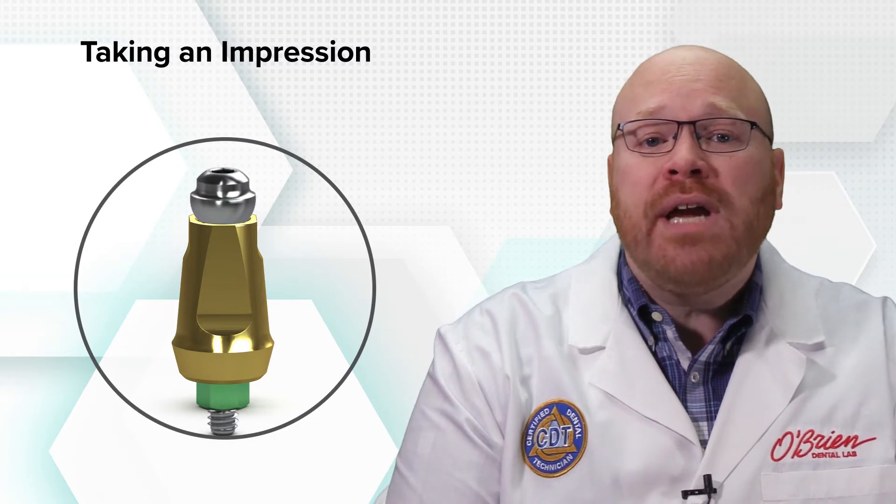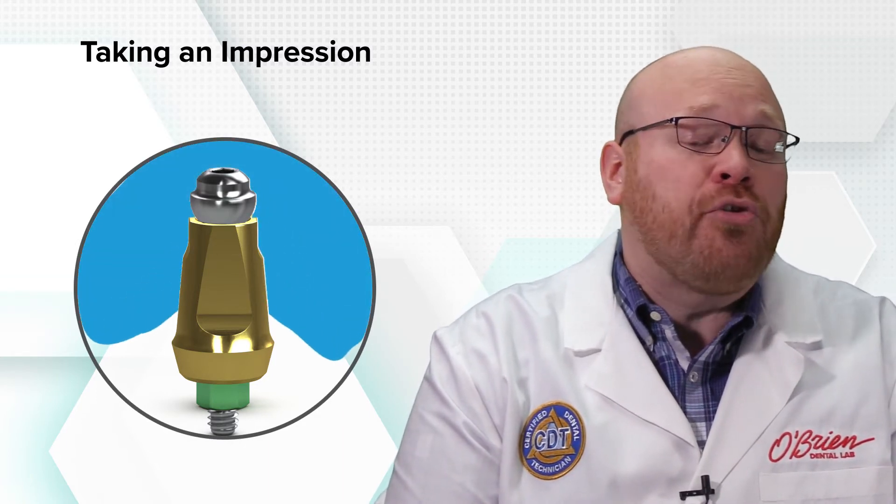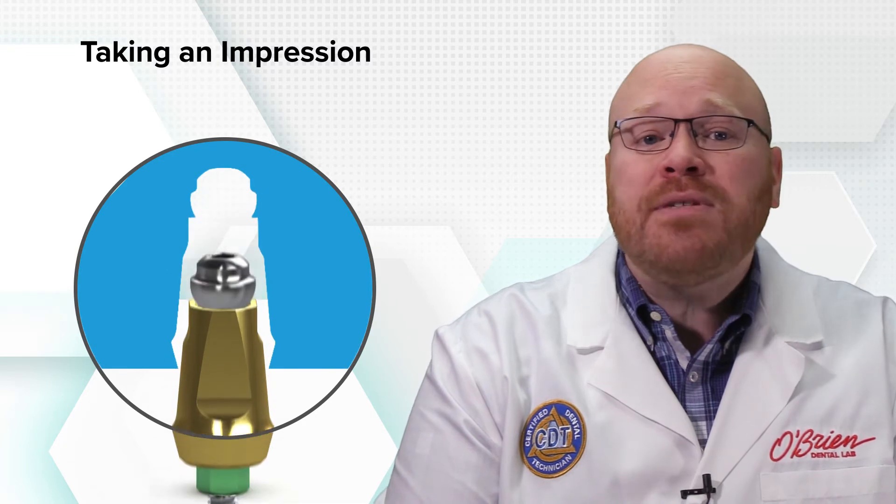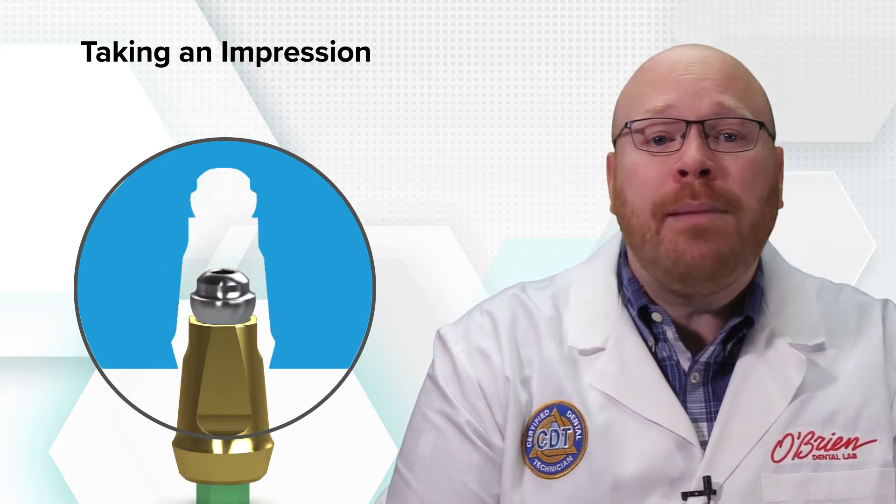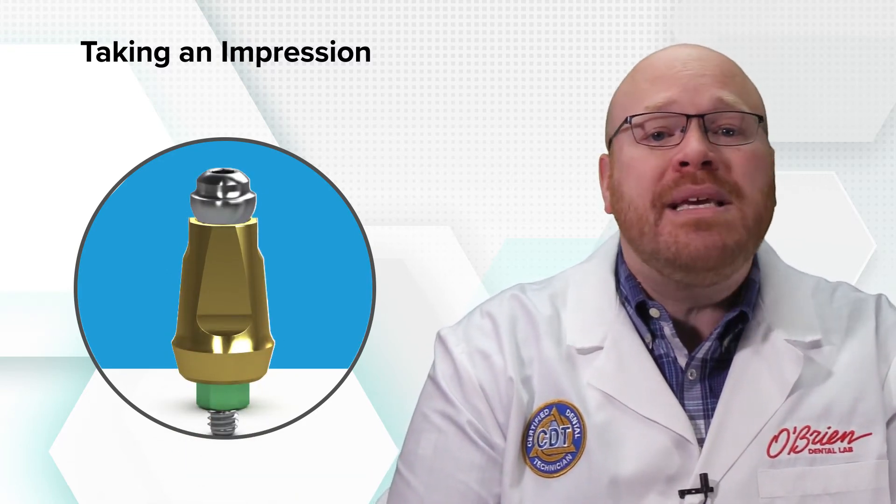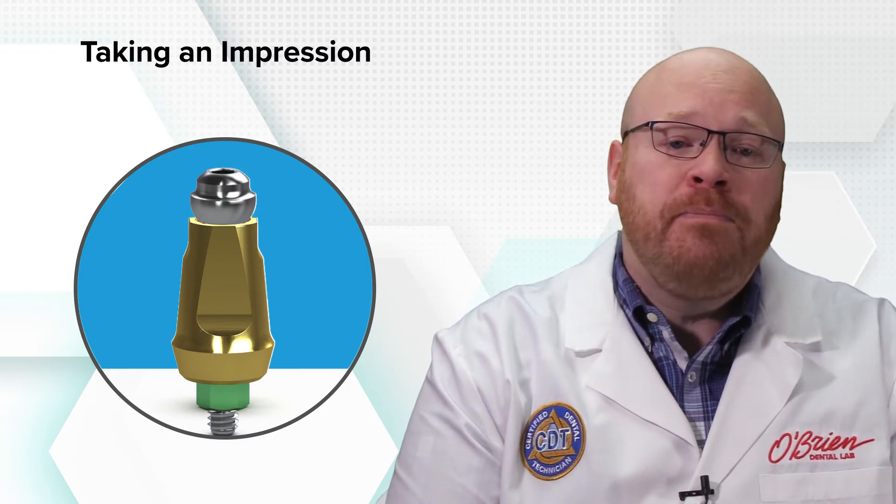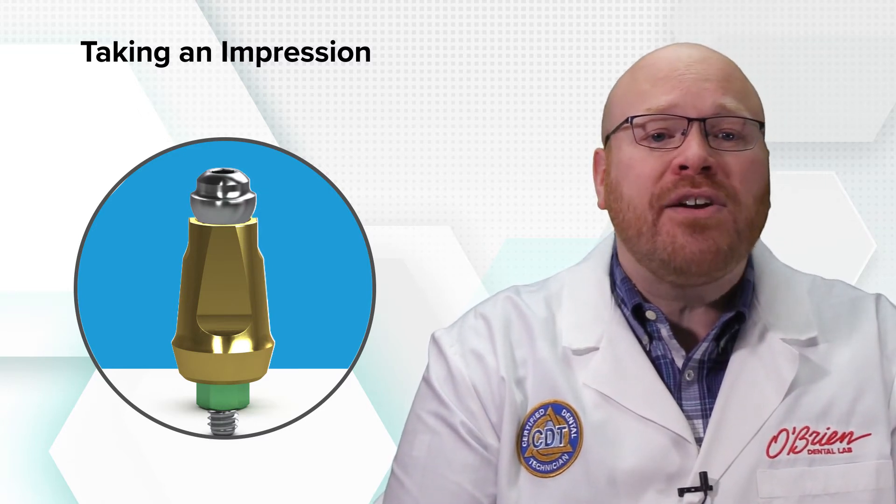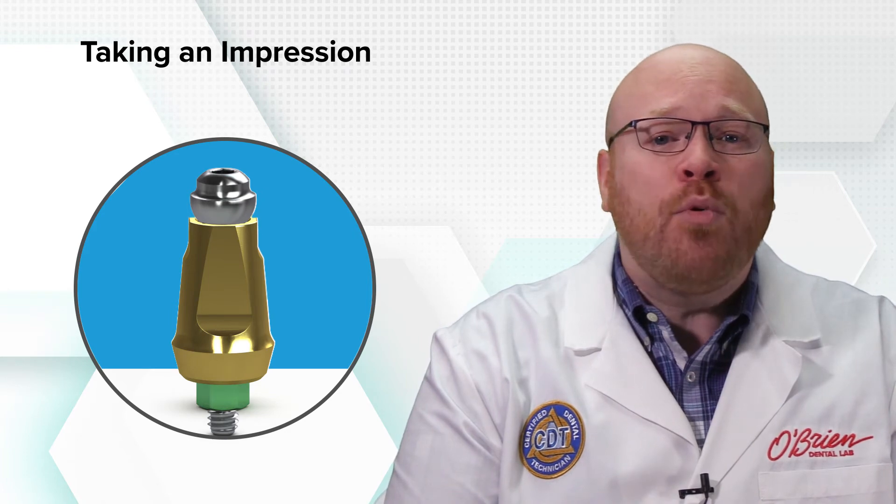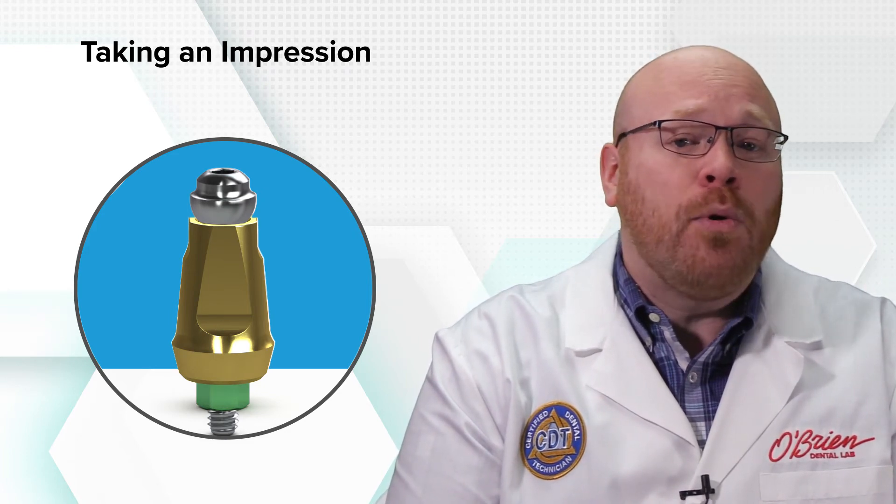This ball top creates an undercut so that the impression material flows into it and creates retention. This allows the abutment to snap into the impression, and more importantly, it prevents the abutment from easily sliding out of the impression. When the ball top isn't used, there is very little retention to hold the abutment in place, which makes it more likely for an inaccurate model to be poured.